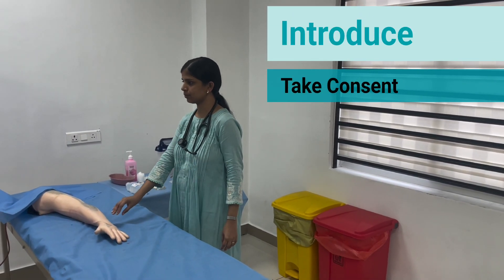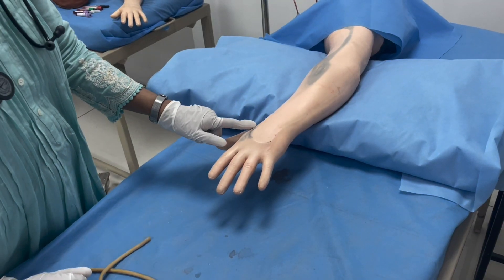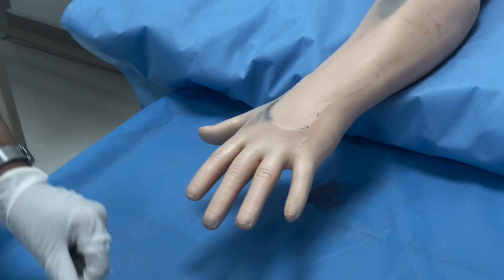Introduce yourself to the patient. Take a verbal consent. Position the patient.